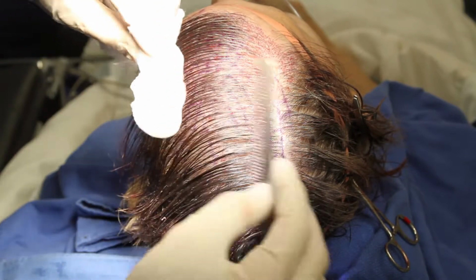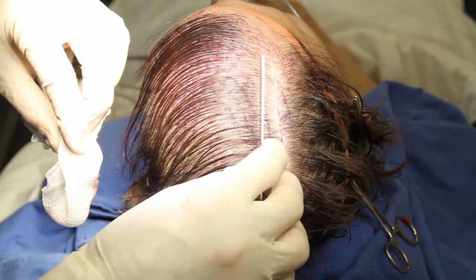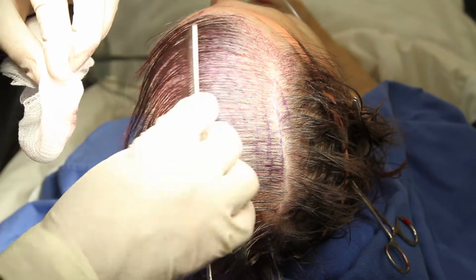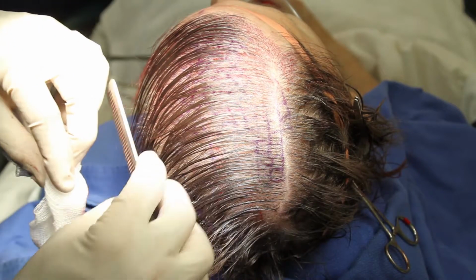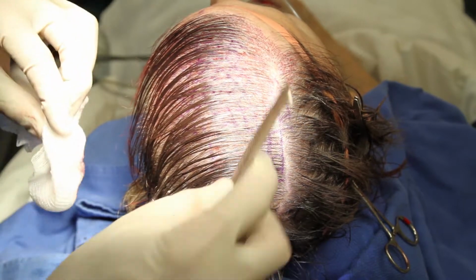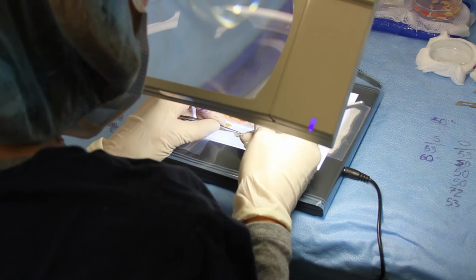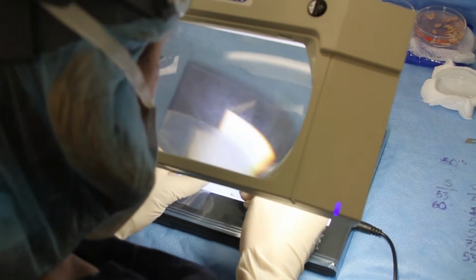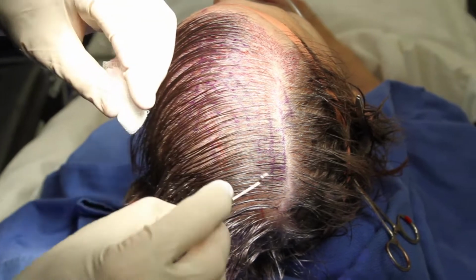These grafts are cut into follicular units, which are 1, 2, or 3 hair units that are the graft themselves, and that's how our hair grows naturally. So we'll be focusing on that and making sure that this density is fully covered. My technicians are in the other room. They're working under microscopic magnification to cut those follicular units, and we're placing these with tiny little cuts that are made with this.